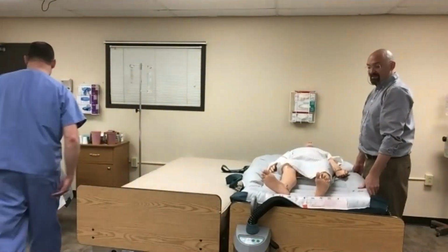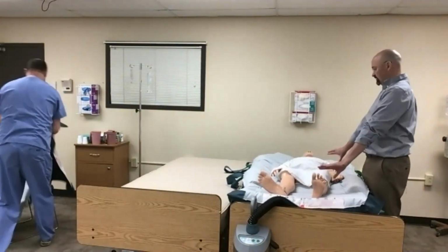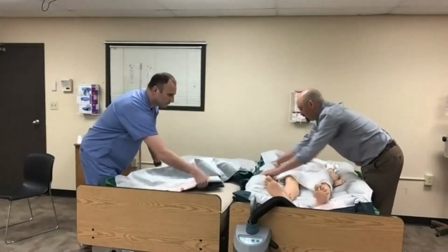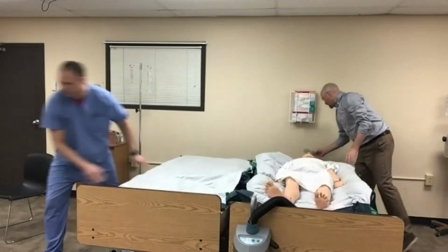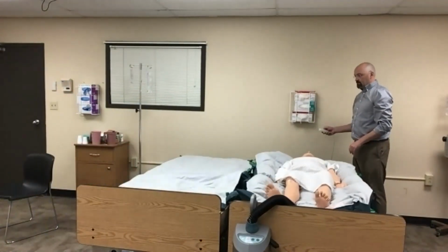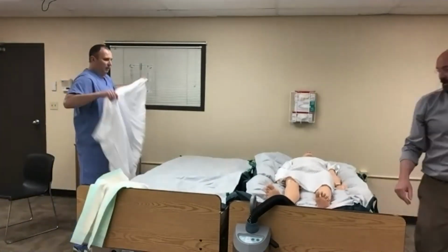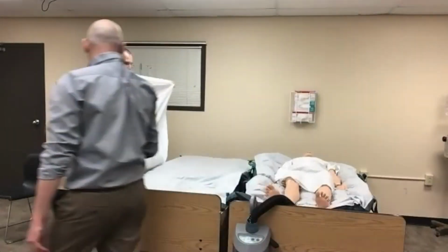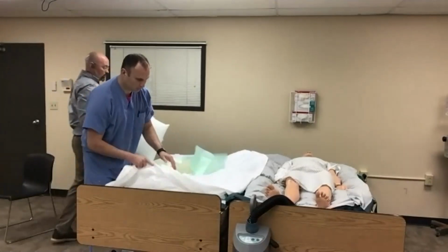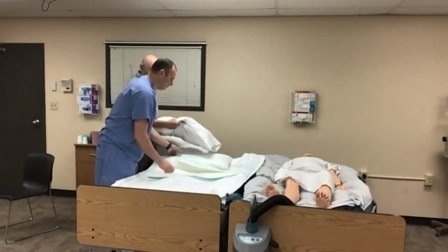Perfect. Now at this time, we're going to be prepping our bed. We're going to be double checking our patient. This will normally only take a few seconds to do. We're going to raise this bed surface all the way to the top, and lower the neck surface down. Prior to that, we're going to place our flat sheet, a HoverMatt, and pillows, depending on where you need the pillows lined up based on your patient.